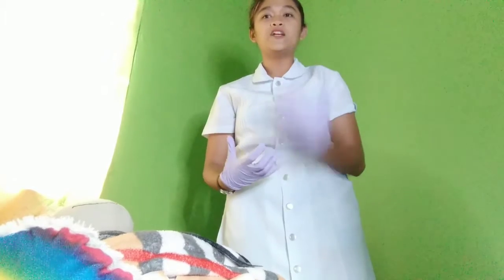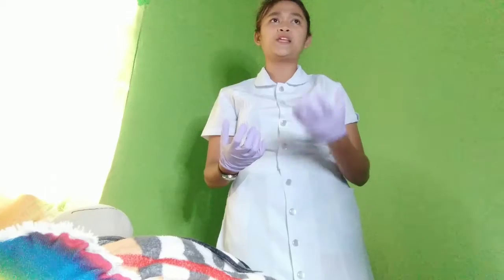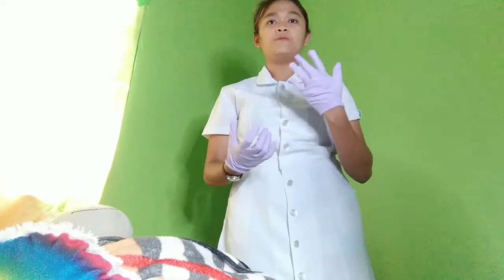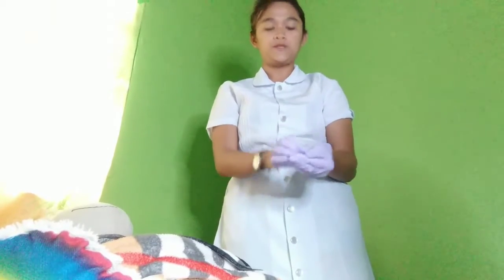So ensure adequate lighting. Adequate lighting helps with accuracy and speed of catheter insertion. So I will remove my gloves now and I will perform my hand hygiene. Hand hygiene reduces the transmission of microorganisms.